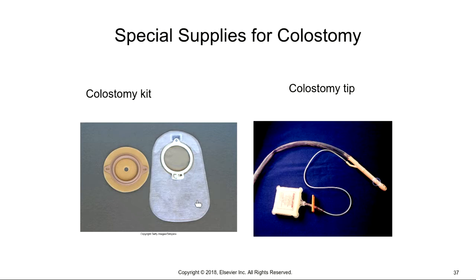So once this bag fills, either with liquid feces or with air, because the patient is still going to have flatus just like a normal patient, what happens is this seal can actually get broken, and then they have an accident where this liquid fecal material leaks on their pants, leaks in their car, leaks on their clothing, and then the smell is just, I don't know how to describe it other than once you smell it, you don't typically forget that. There's certain smells in our field that you never forget. Burning flesh, a GI bleed, and a colostomy are just some, to name a few.